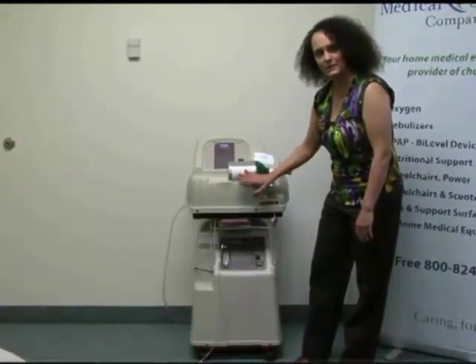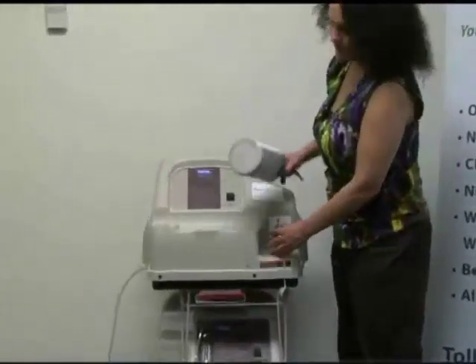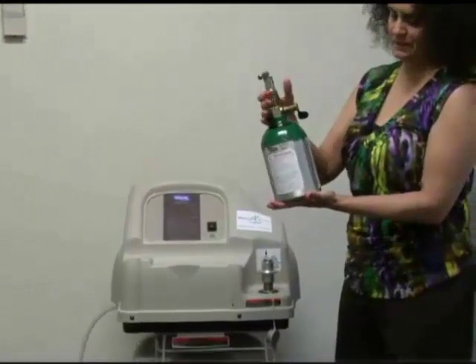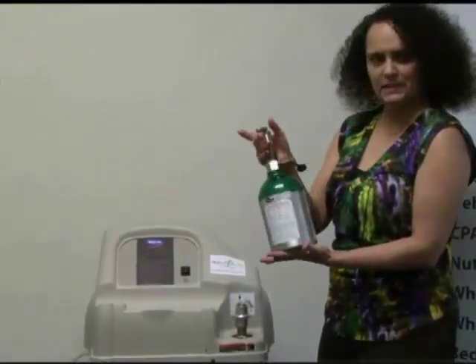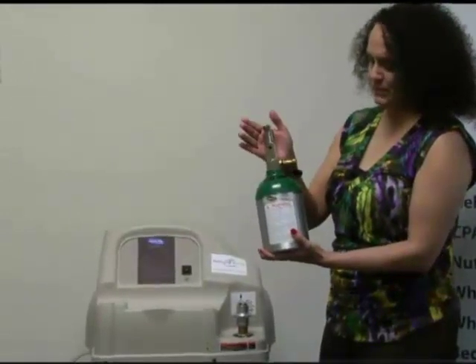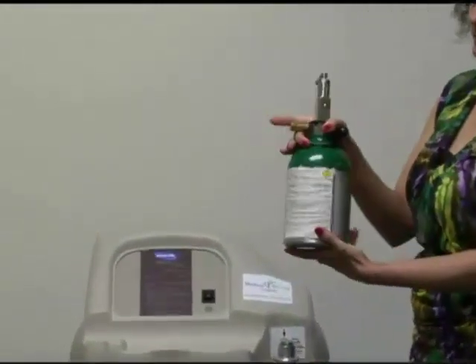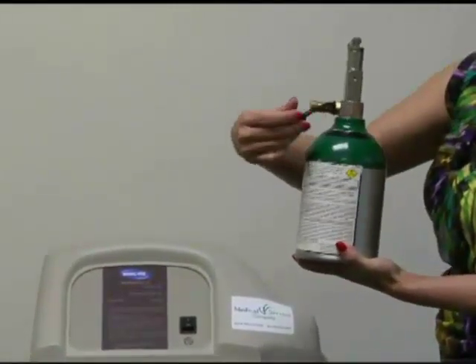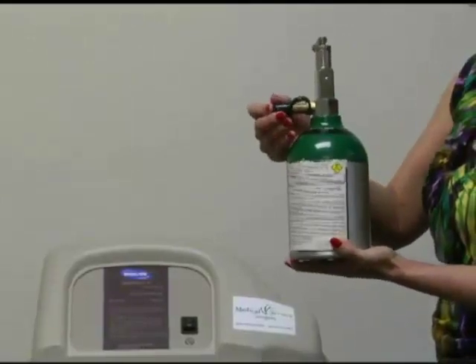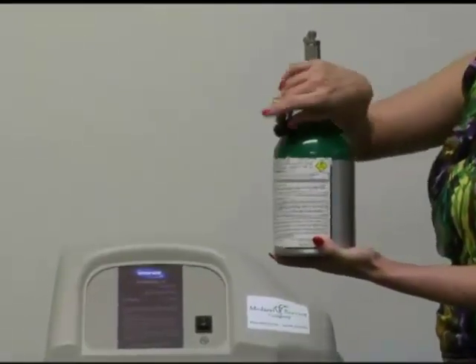Now we're going to focus on the top — this top part is the home fill. This is one type of home fill tank; they come in different sizes but they'll always look about the same. They should be green. This one has a post on top. The important thing to notice is this brass post that sticks out. It does come with a little cap on it that you will have to take off to actually fill the tank, so you will take the cap off.